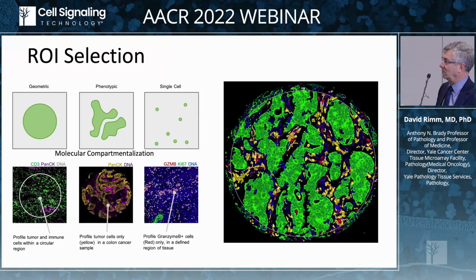And so as a result, you can do a phenotypic, or what I would like to call molecular compartmentalization, to define your regions of interest. I think this is a great tool for discovery, because you can tell the region of interest even though you can't tell which cell it is, and then once you've found interesting candidate markers, you switch back to quantitative fluorescence, where you might only do 3 or 4-plex, but you then have the submicron resolution that we've come accustomed to with quantitative fluorescence.